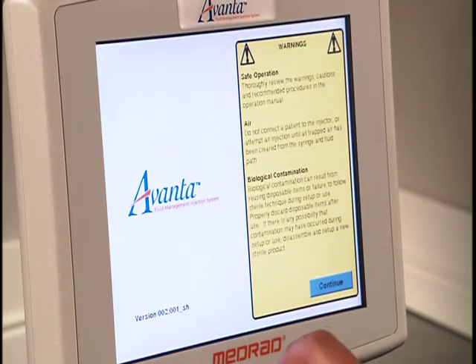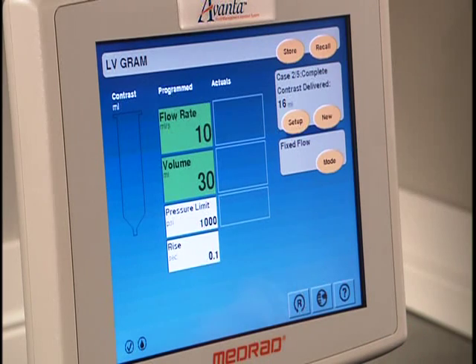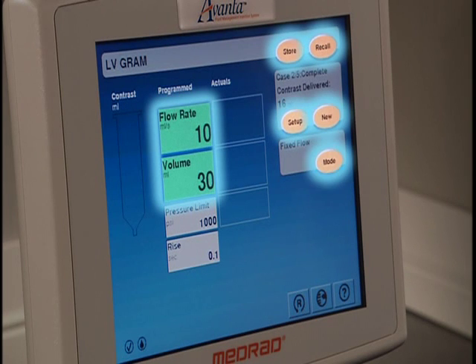Touch Continue to advance to the main screen, which is used for disposable setup, programming, arming, and injecting. Any gold or green highlighted buttons displayed on the touch screen are action buttons. Simply touch the screen for programming.